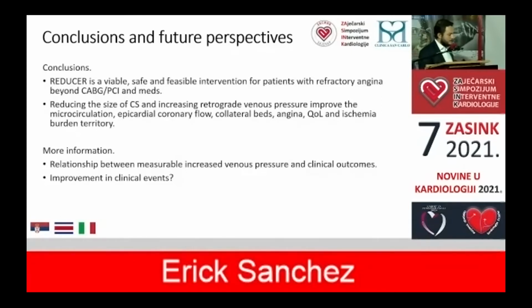A few things that maybe in the future, I am proposing we should also measure the pressure after the stent inside the coronary sinus. For example, 3 or 4 months after the implantation, to see if there is a real increase of pressure and to find the connection between the pressure and the good clinical response.